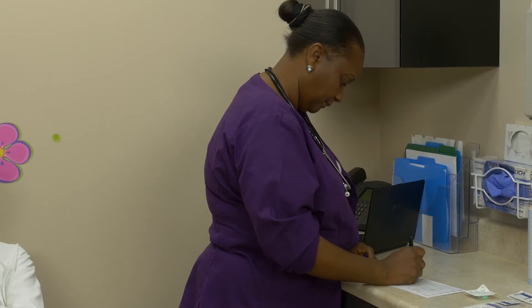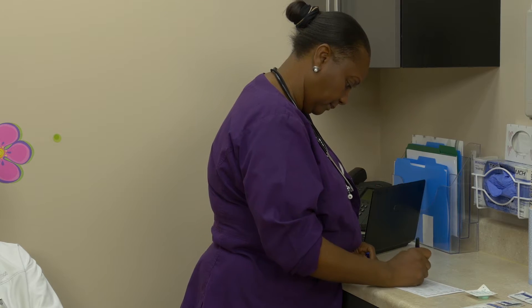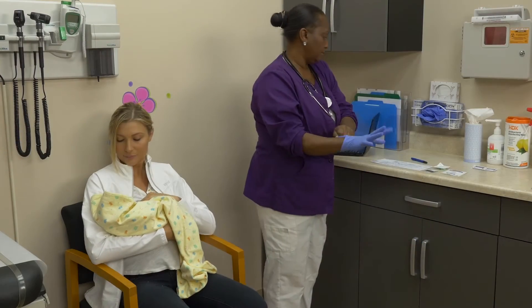Use a marking pen to label the test card with the patient's and provider's information. Apply gloves.